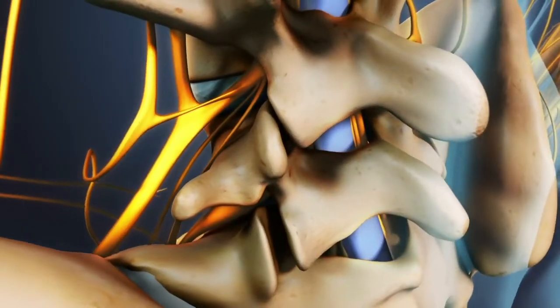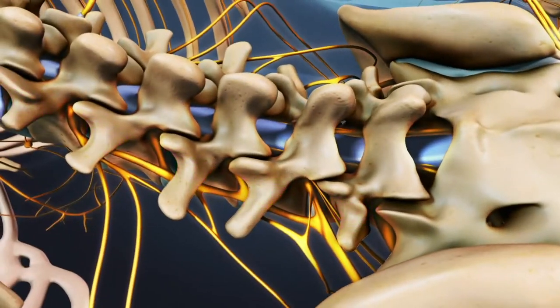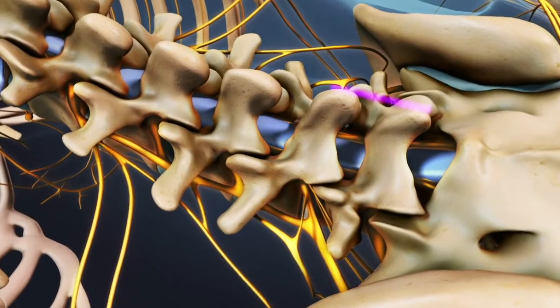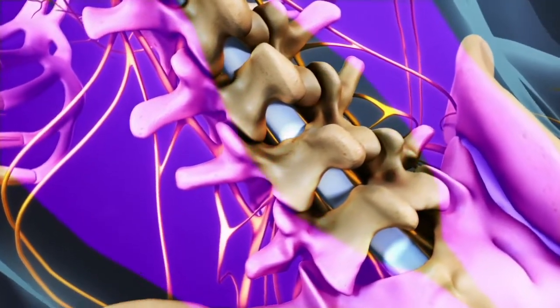The surgery involves placing a bone graft in the posterolateral portion of the back of the spine. The procedure begins with a 3 to 6 inch long incision in the midline of the back. The back muscles surrounding the spine are then retracted to the side.